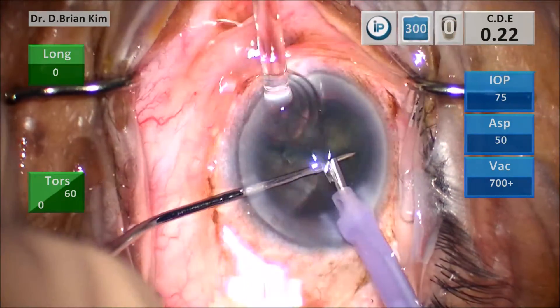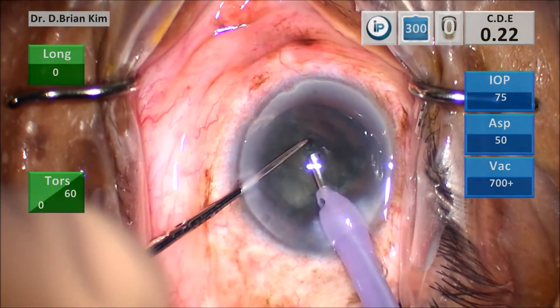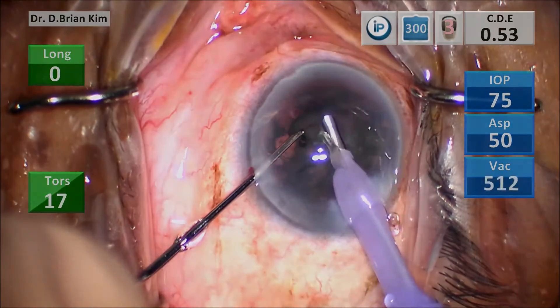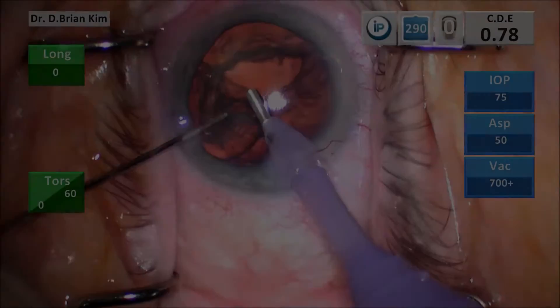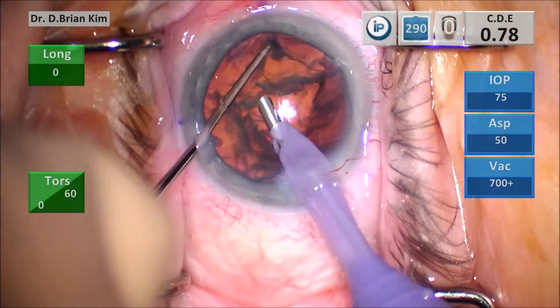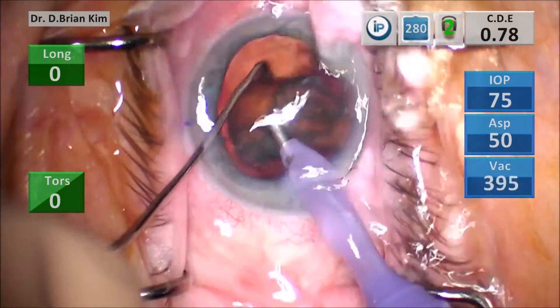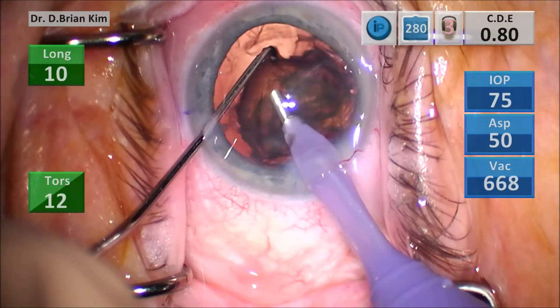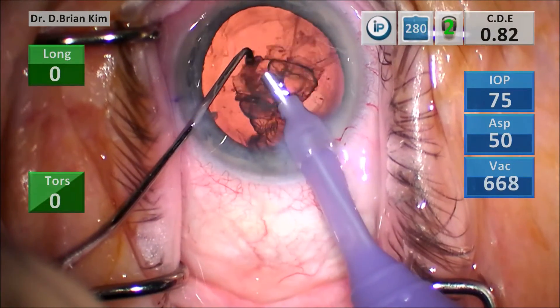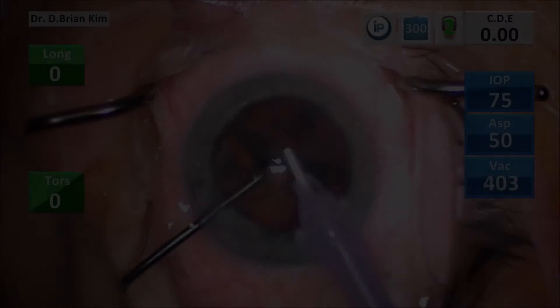That didn't work very well, so I rotate it again and retry the same maneuver. Just don't give up — if you have difficulty, go back and retry. I was tempted to grab that fragment with the phaco tip but decided not to, using my chopper instead. That was a wise decision — I was able to pull it centrally without difficulty and the rest came out easily.